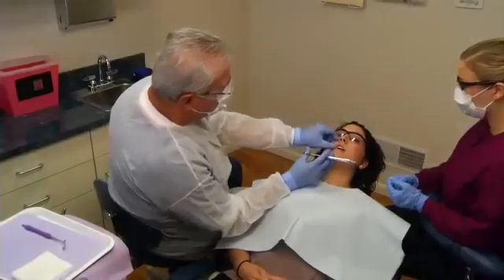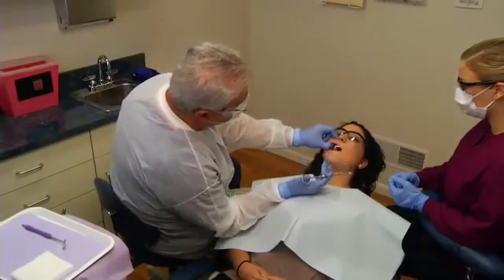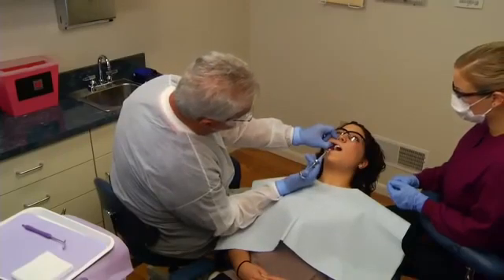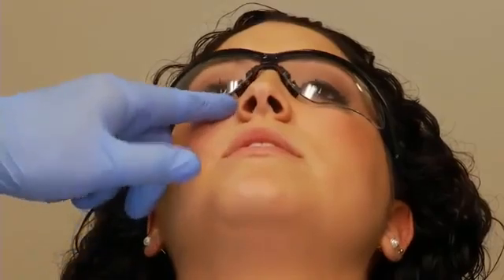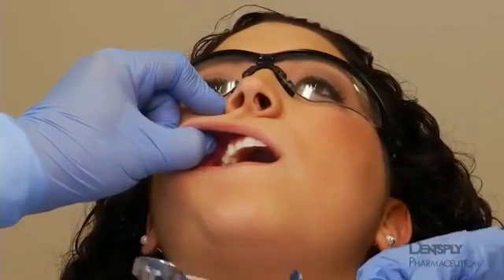For a right-handed operator performing a right infraorbital nerve block, the clinician should be seated in front of the patient with the patient's neck extended and the head turned to permit visualization of the right premolar region. The mouth may remain closed. The left index finger is placed over the infraorbital foramen and the upper lip is retracted by the thumb, pulling taut the tissues in the mucobuccal fold.